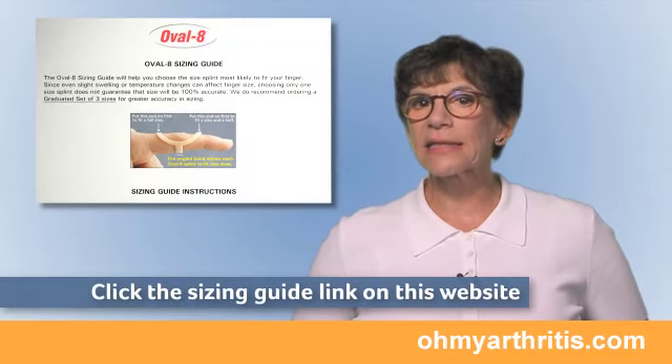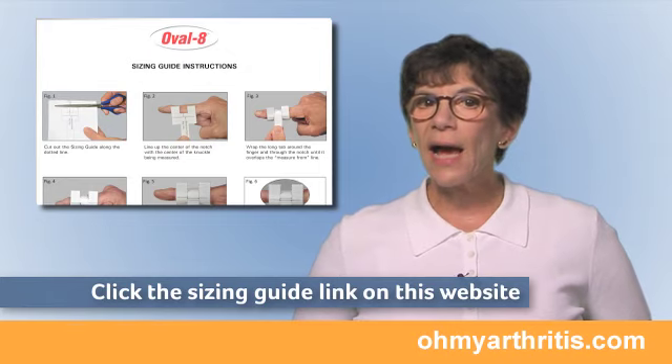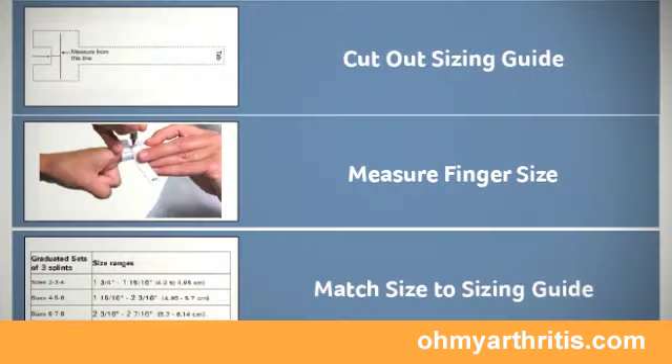If your health care provider does not have the sizing set, the next best way is to click the Sizing Guide link on this website and print out the Oval 8 Sizing Guide that includes the step-by-step directions that I'm going to demonstrate in this video.